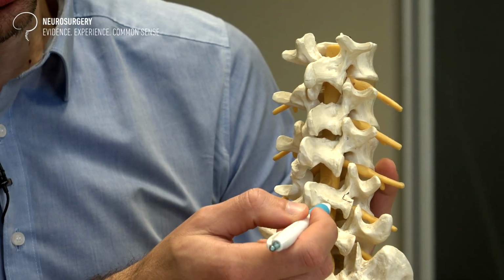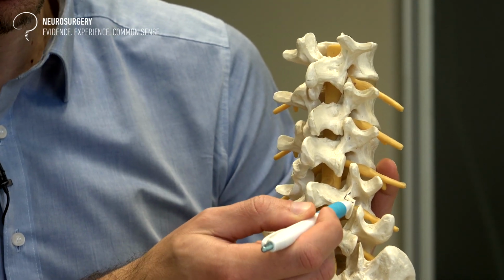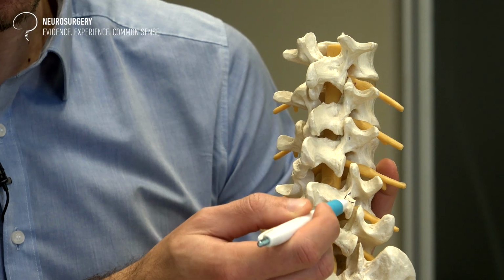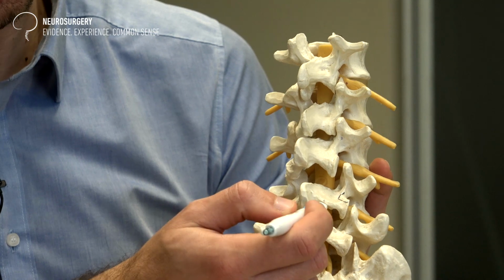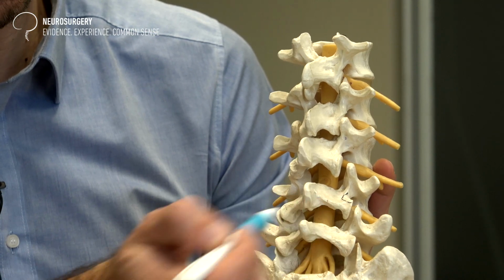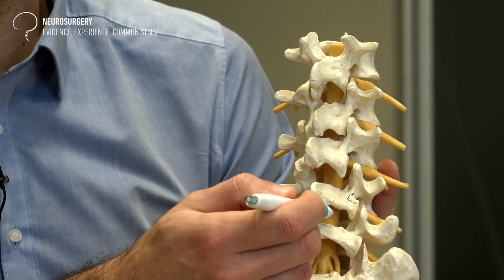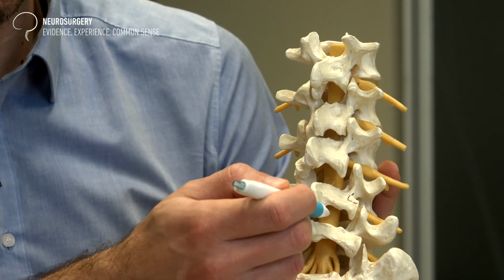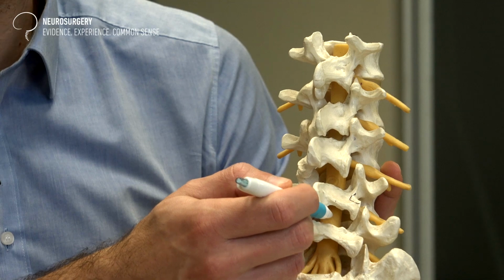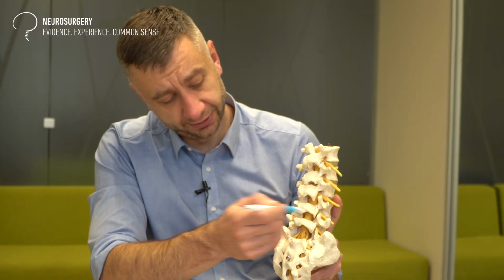Then we can identify the lumbar lamina of L4 and the lumbar lamina of L5. So we know that we need to enter this interspace. Then we do another X-ray just to make sure that we are still on the right track, that we have not deviated from the initial plan.